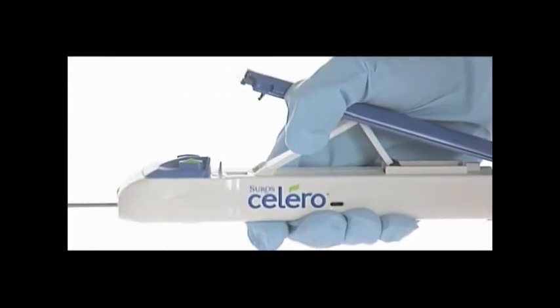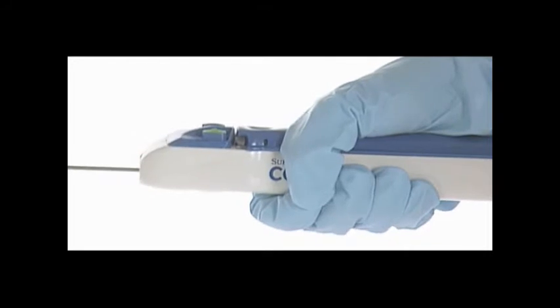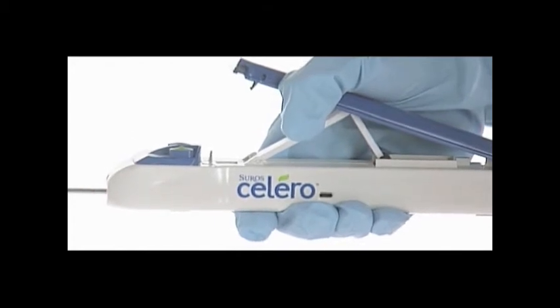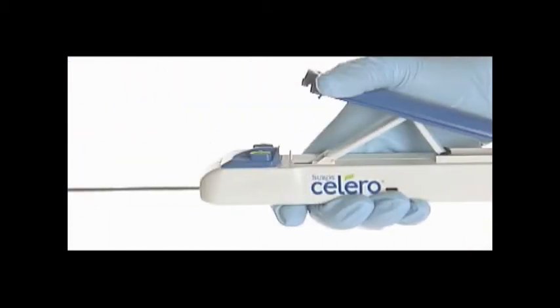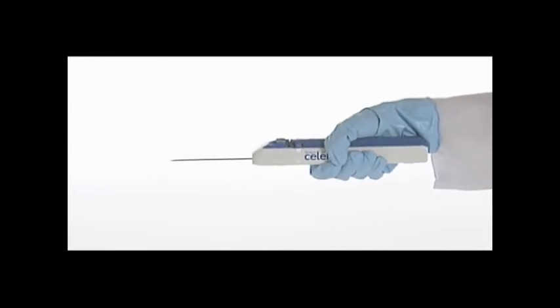Using the palm surface of your hand, fully compress the actuating lever. This first compression primes the vacuum. Release hand pressure to open the actuating lever in preparation for the second compression. Compress the actuating lever a second time to retract the outer cannula. Release hand pressure to open the actuating lever in preparation for the third and final compression. Compress the actuating lever a third time to retract the inner cannula.